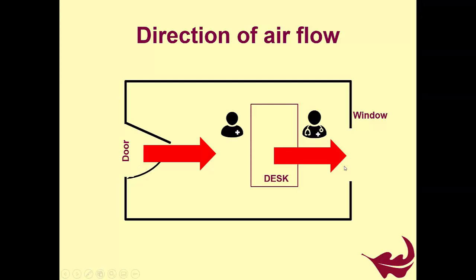What you want is airflow away from the healthcare worker, and obviously we want to make sure that we don't work when we are ill, because then we can infect the patients. So both of these examples are actually not ideal.